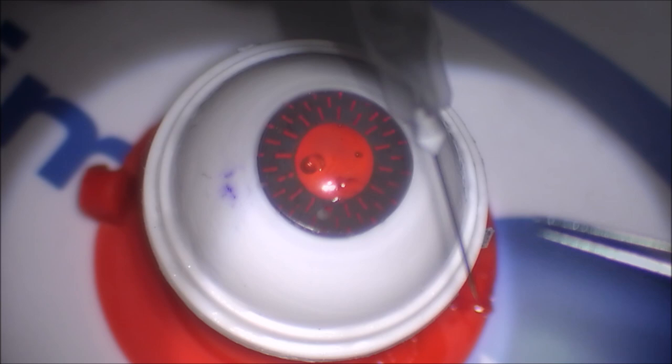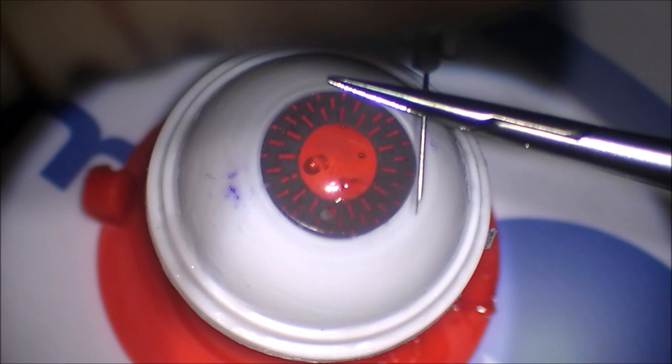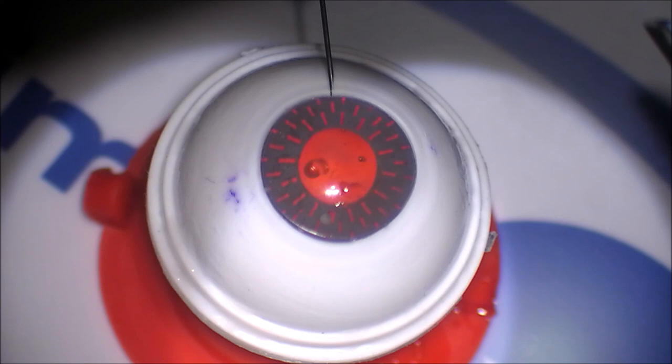And this is my 25 gauge needle, which I'm going to use to externalize the leading haptic. Again, this is my modification, so this is not quite how Yamani intended it. But I'm going to go ahead and externalize the leading haptic so I can cannulate the trailing haptic first.